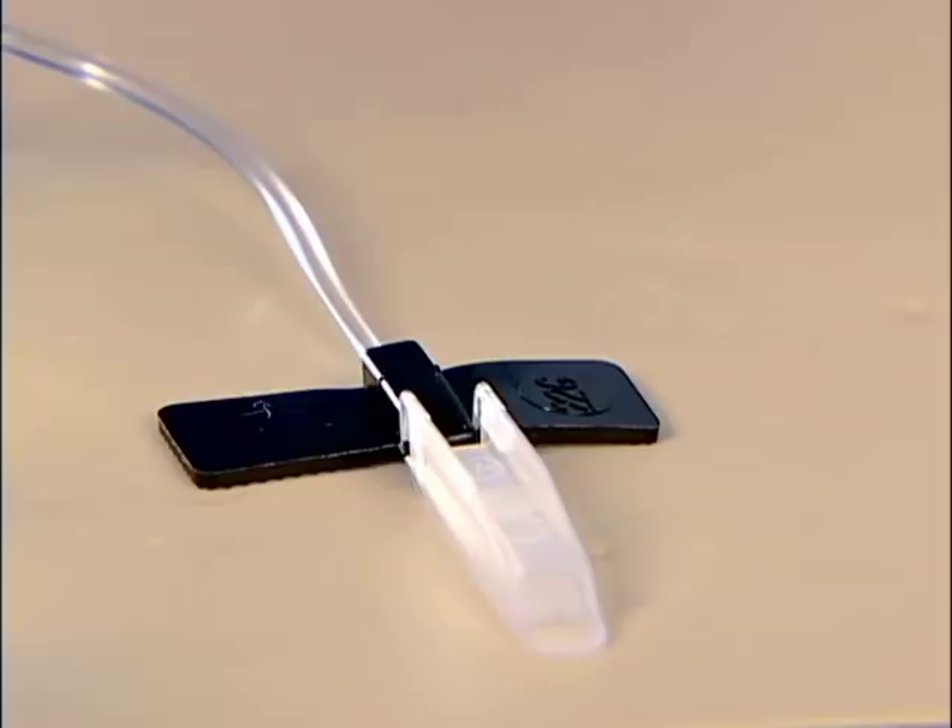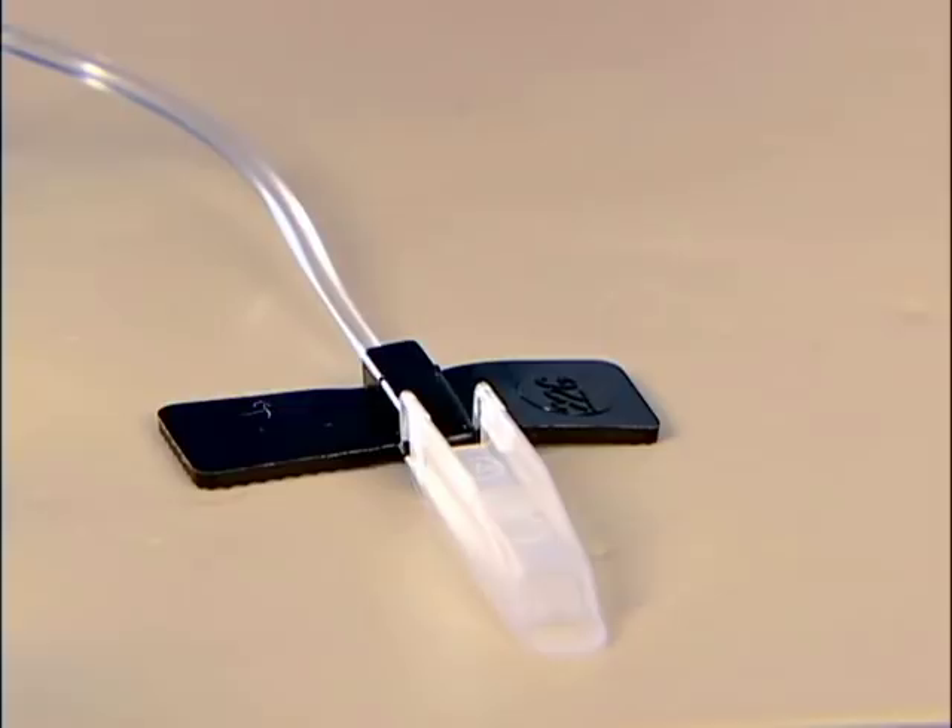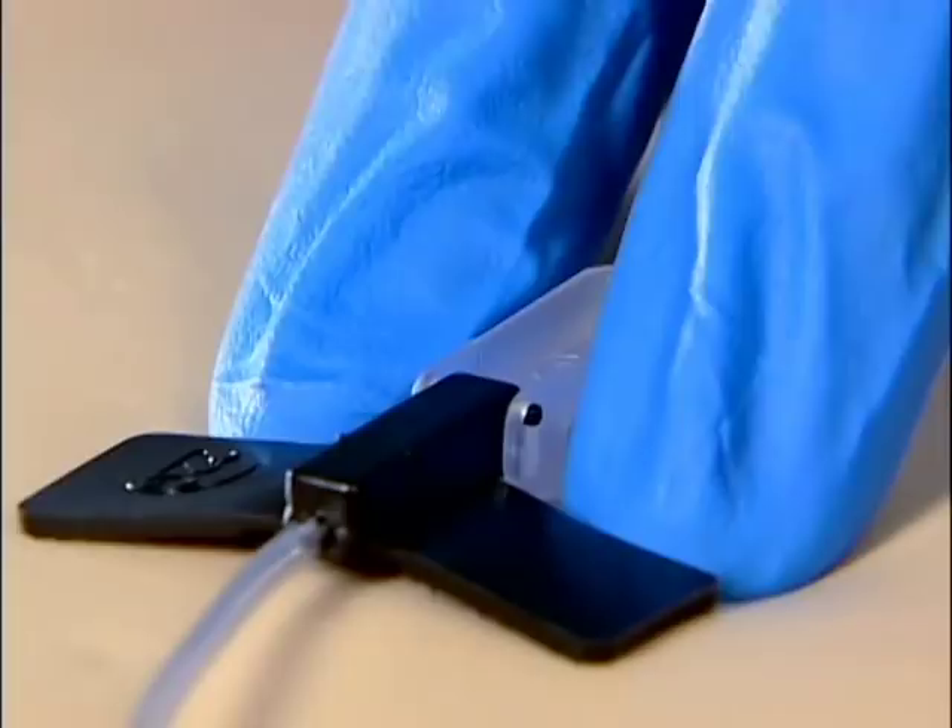To remove the Huber Pro, stabilize it by placing the tip of your index finger between the wings. Grasp the wings using your thumb and middle fingers. Some may find it easier to bend the middle finger when grasping the wings.